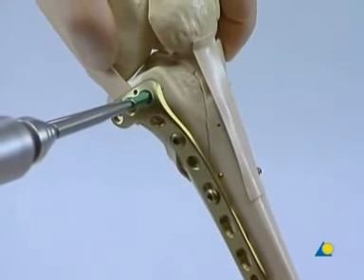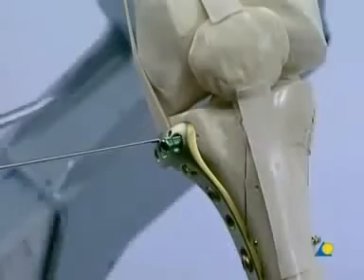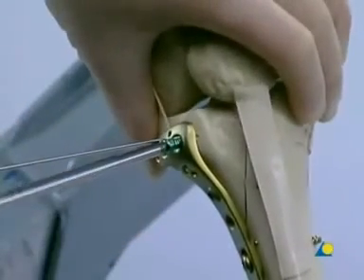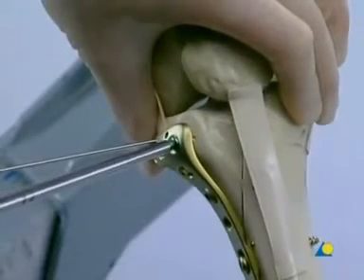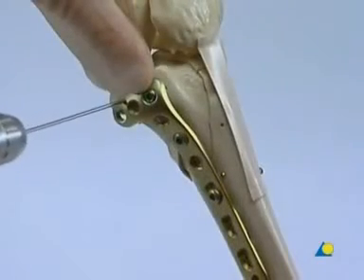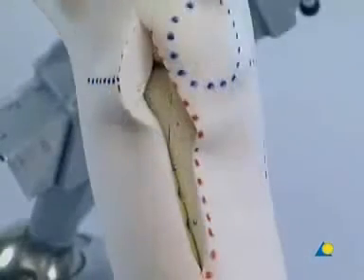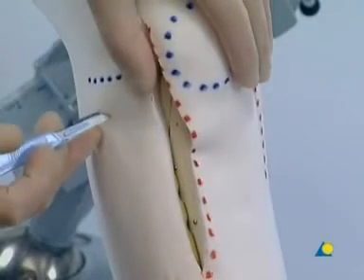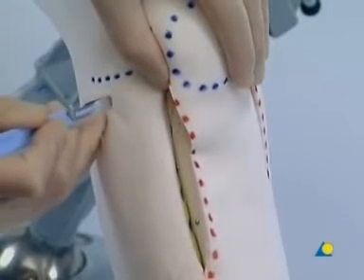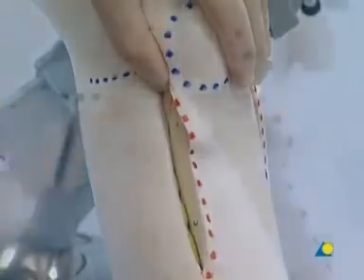After beginning with a power tool, the insertion is completed by hand, using the large hexagonal screwdriver with integrated torque limiter. The posterior K-wire is removed. The more posterior plate holes in the L plate are usually hard to reach through the anterior incision. A separate stab incision is appropriate.